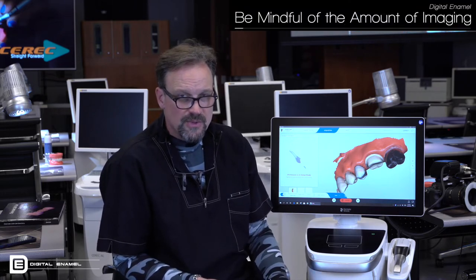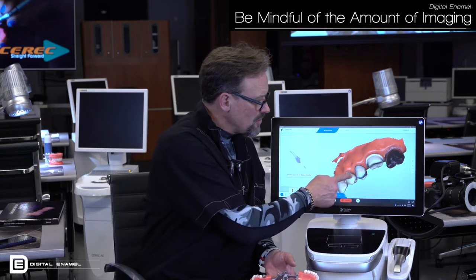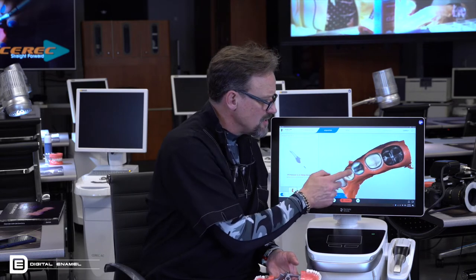And the problem with that is when you go to the next step, it sits there and processes and processes. And we've all sat there and waited. It could be that you're imaging way, way too much. In fact, I can almost guarantee you that you're imaging way too much because I've watched it countless times. So if you look at this model right now, again, I just need to fill in those few areas.